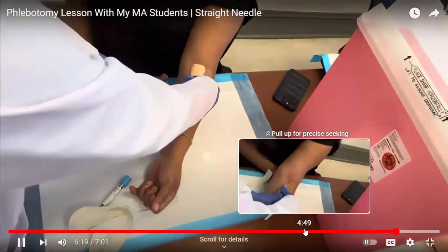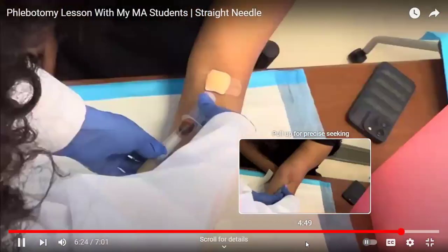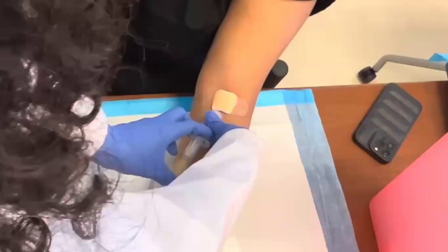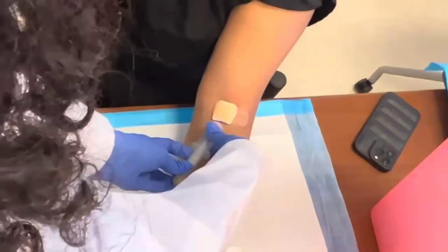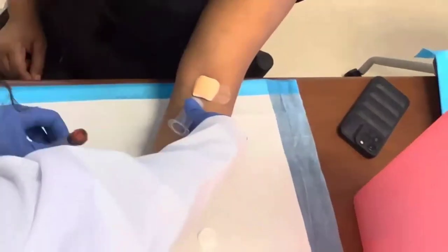So in order to keep that needle from coming out, you want to press on your flange. So again, we want to go in and hold our flange, coming out. We want to press against it either with our index finger or your thumb, either way, okay?